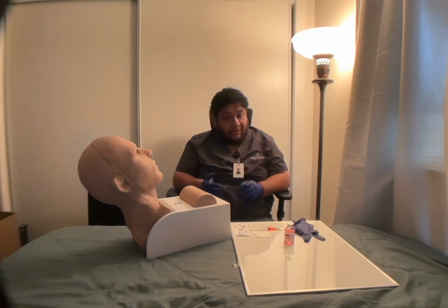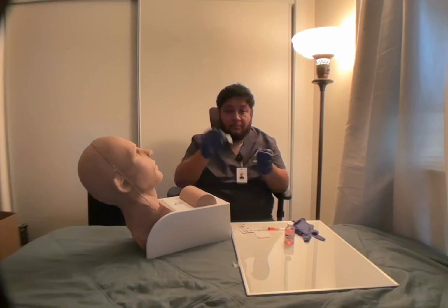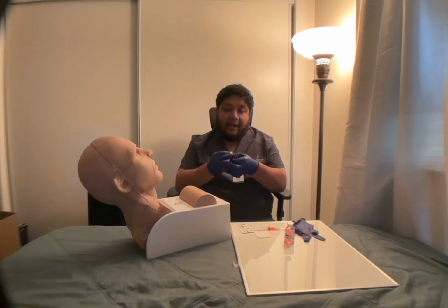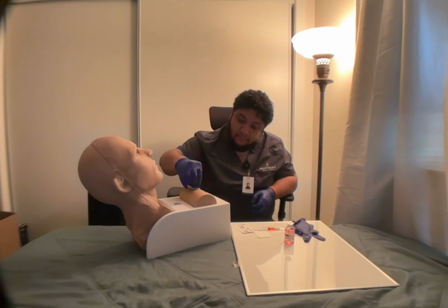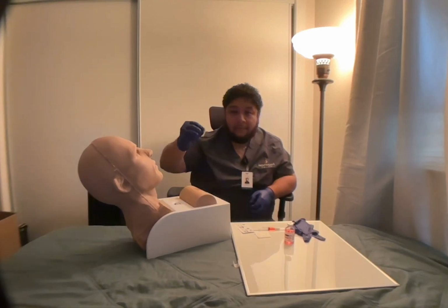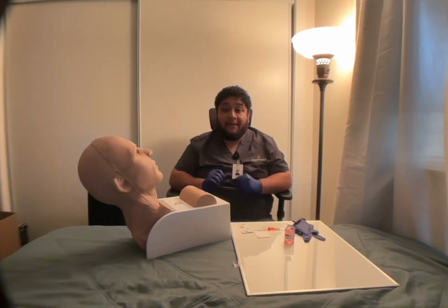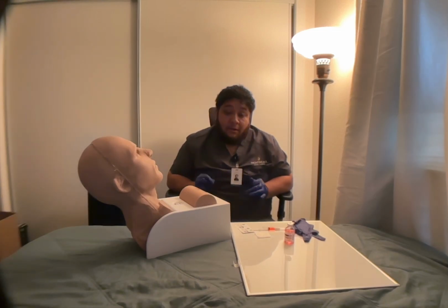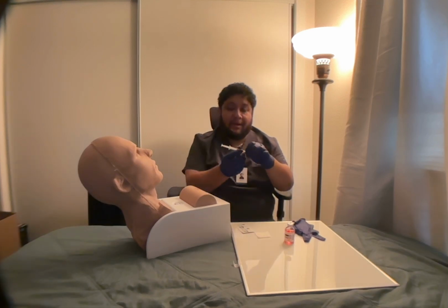So now, I'm going to clean the site with an alcohol swab. Discard. Now I'm going to start inward, and I'm going to go 2 inches outward, like so. Discard. Let it dry. I will not touch that site again. Now that it's dried, I'm going to remove the needle cap from my syringe.